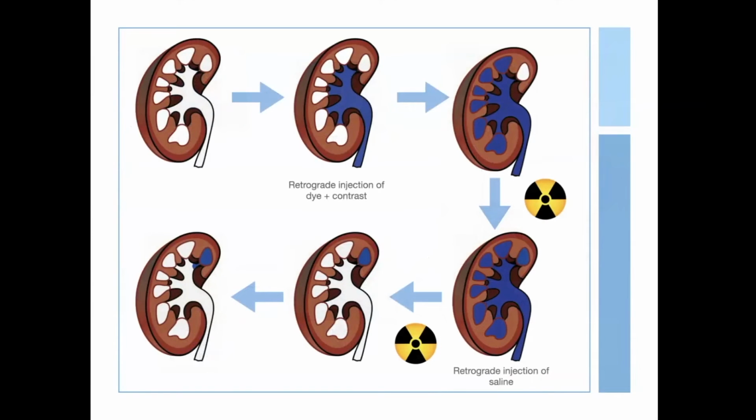If you have difficulty finding the diverticulum, one thing that you can do is to inject blue dye into the kidney in a retrograde manner that will fill the diverticulum. And then as you wash the rest of the blue dye out of the kidney, you'll often see blue dye escaping from the diverticular orifice when you do your ureteroscopies. This can be very helpful.